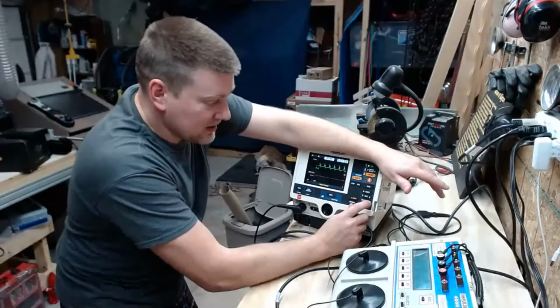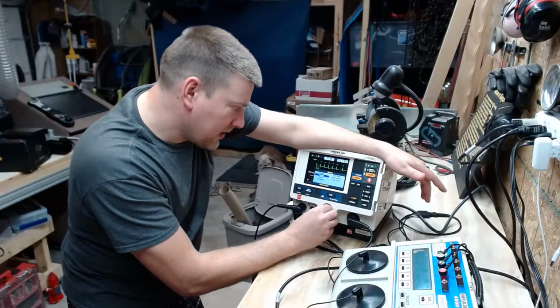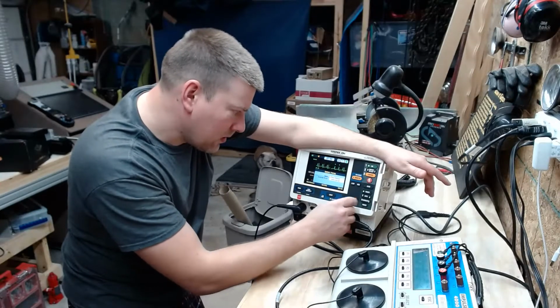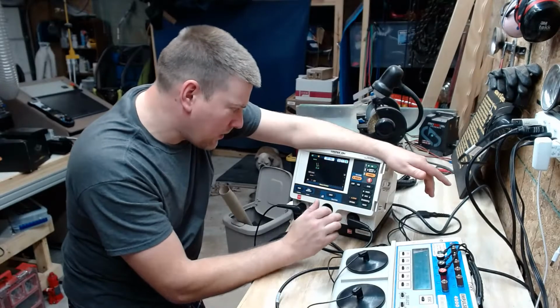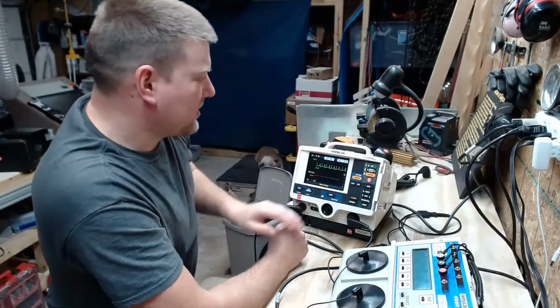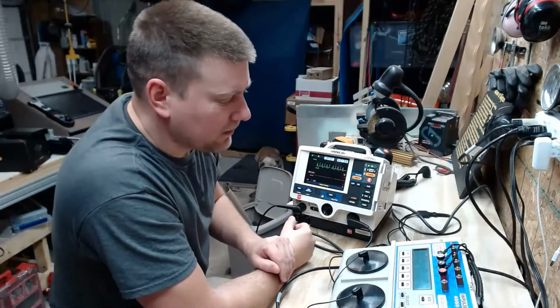If this was in synchronous mode or demand mode, hold on a second. Let me make sure. Okay, so this is non-demand mode, and you can see that no matter what, it's giving out the pulses, and it doesn't care.